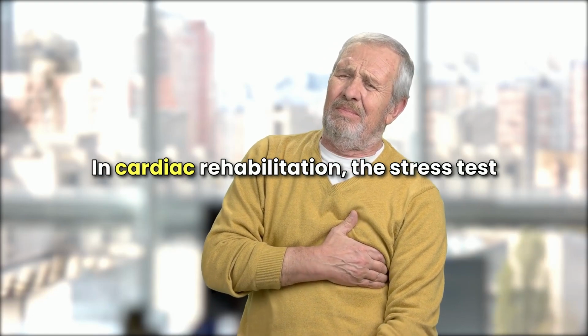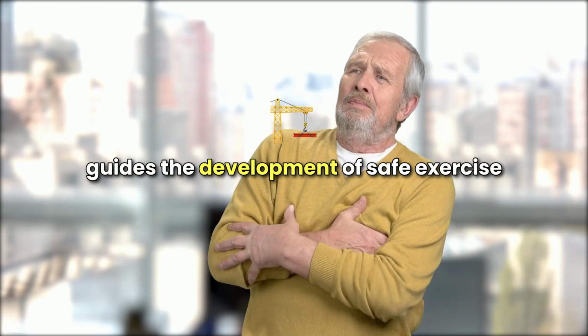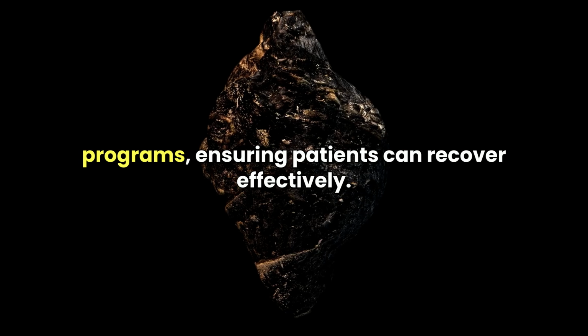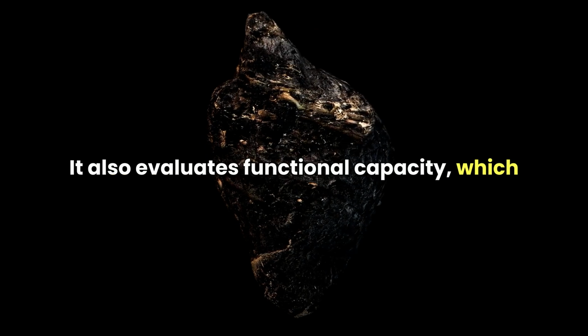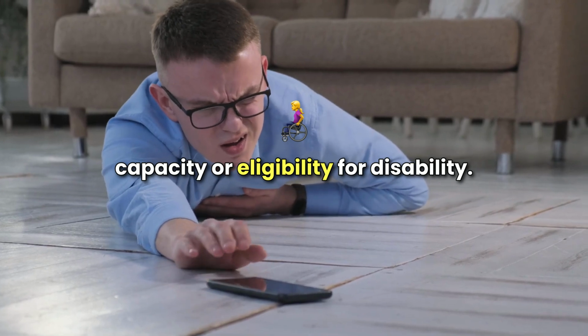In cardiac rehabilitation, the stress test guides the development of safe exercise programs, ensuring patients can recover effectively. It also evaluates functional capacity, which can be crucial in determining work capacity or eligibility for disability.